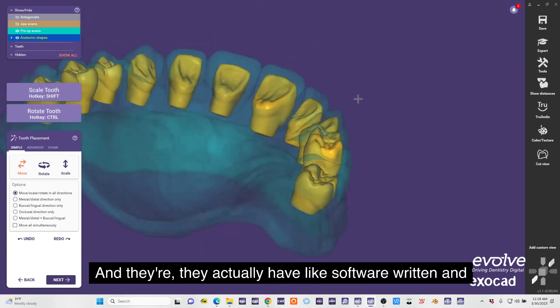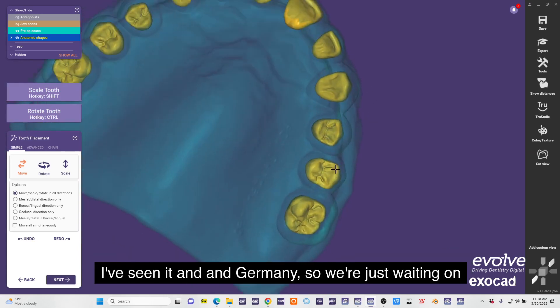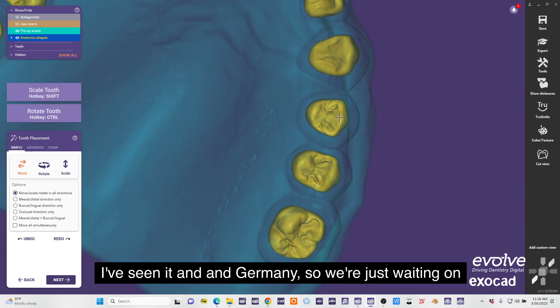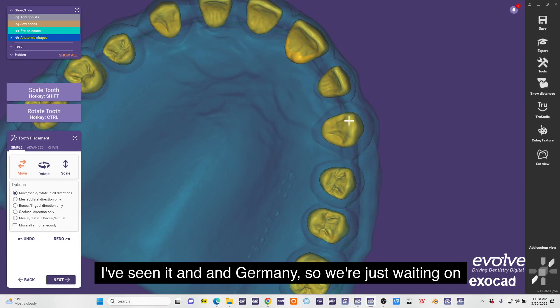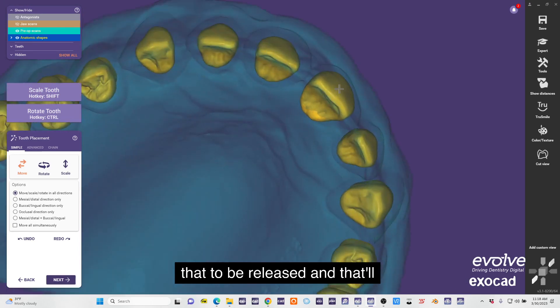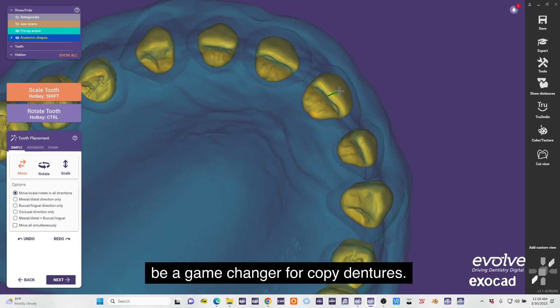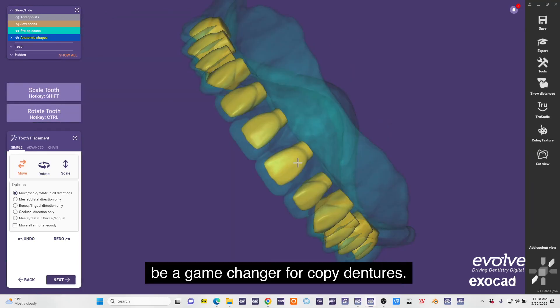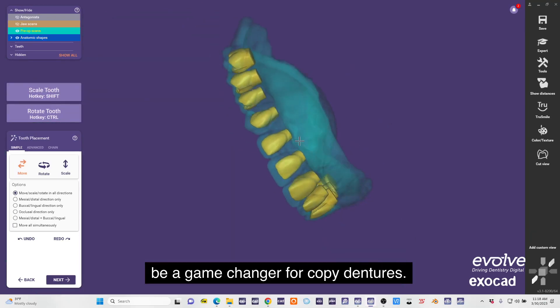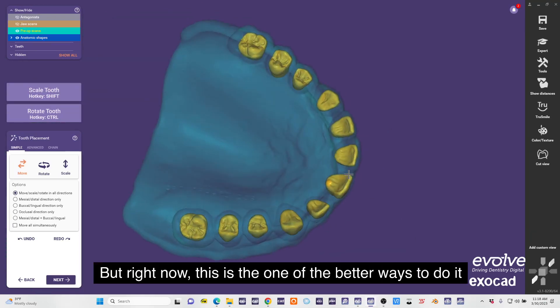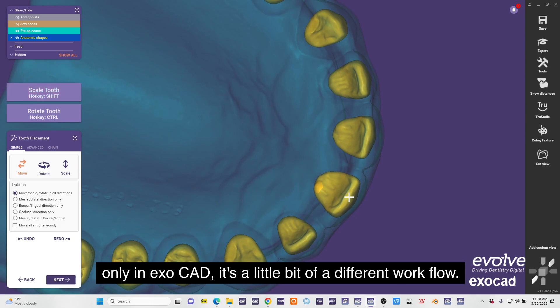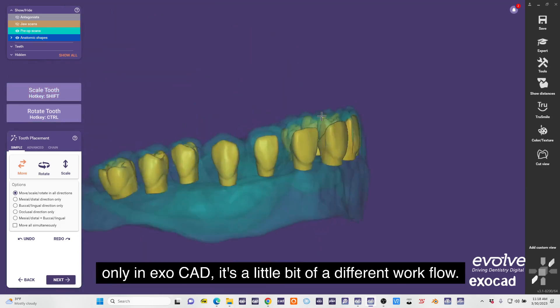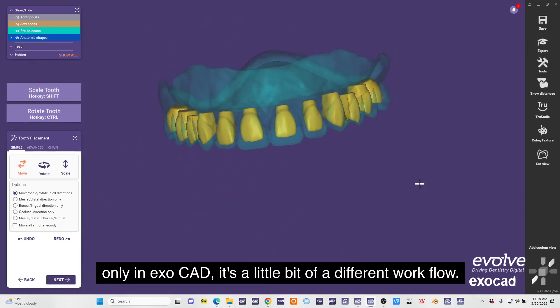I know Exocad they're making a copy denture actual workflow and there they actually have a software written - I've seen it in Germany. So we're just waiting on that to be released and that'll be a game changer for copy dentures. But right now this is one of the better ways to do it in Exocad, it's a little bit of a different workflow.